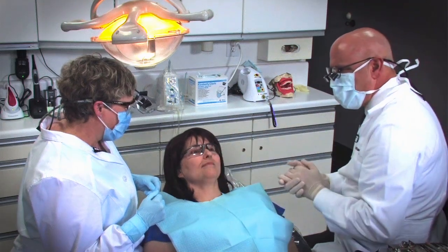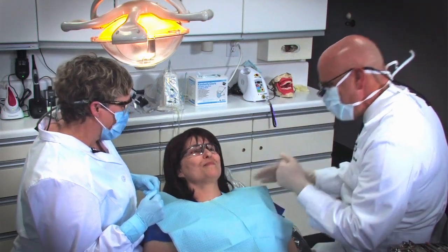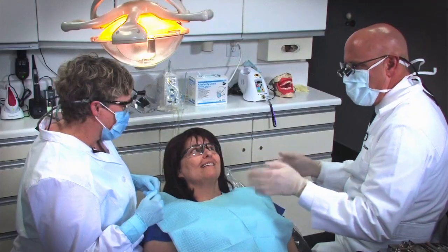And as a dentist, here you are at Pierce College teaching the hygiene students how to do it, and you and I as dental students didn't get to learn how to do it. So I'm going to make a demand of the ADA that they step in and do this. I thought maybe just because I'm old I didn't learn it, but she graduated this year and still didn't learn it. So she wanted to experience one, and this will be good for both of us. So how do we get started?